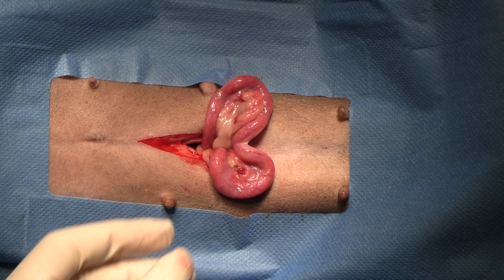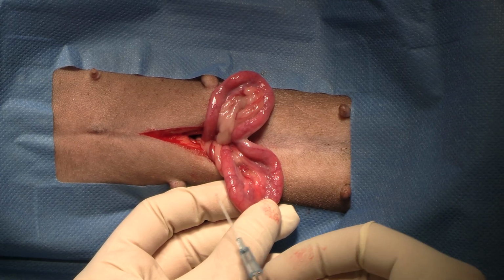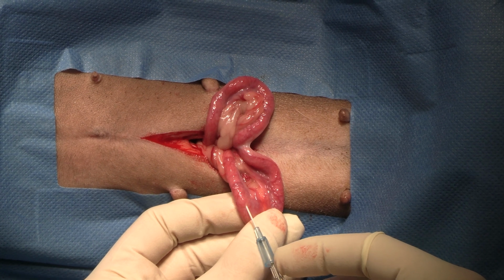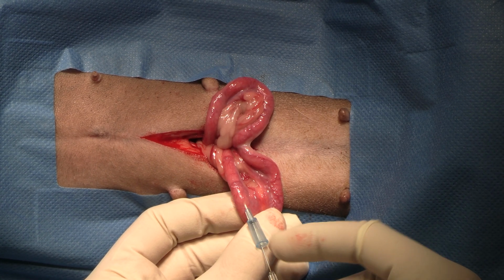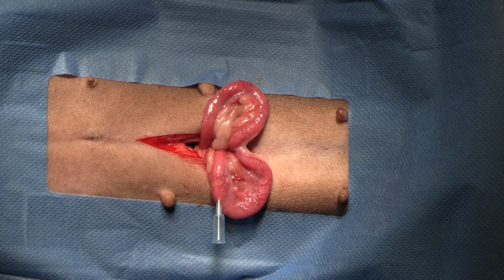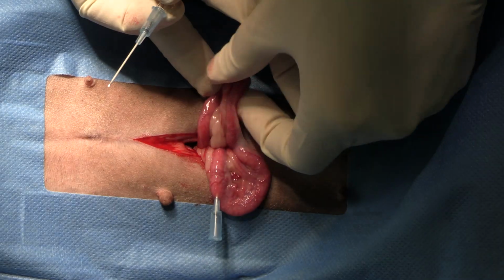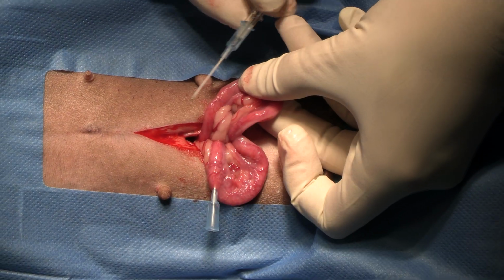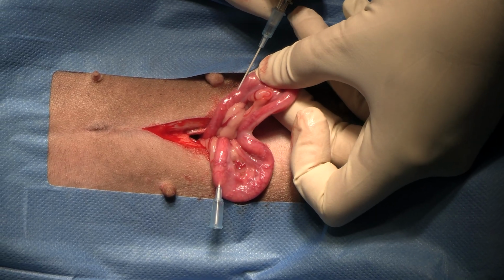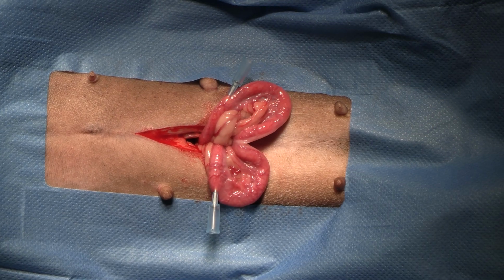Unlike with a vein where you get flashback, you don't get that. So we direct it where there's no vessels, into the middle, and we push off. And we know we're in based on resistance. It should advance really easily. Same thing, finding an area with minimal vessels. Coming to the center, pushing off. Advances really easily.